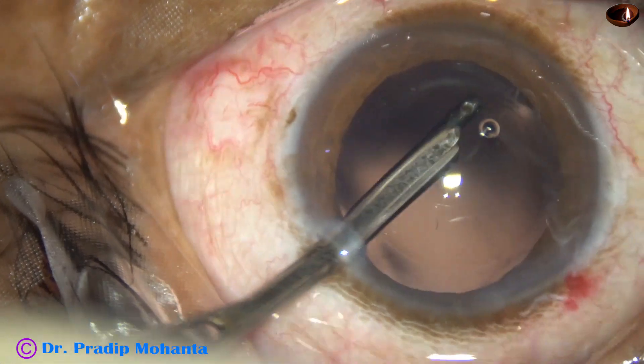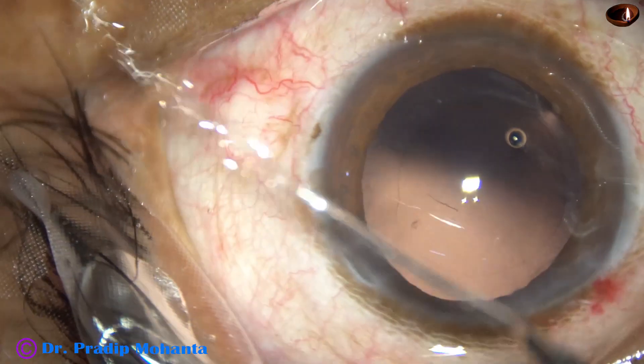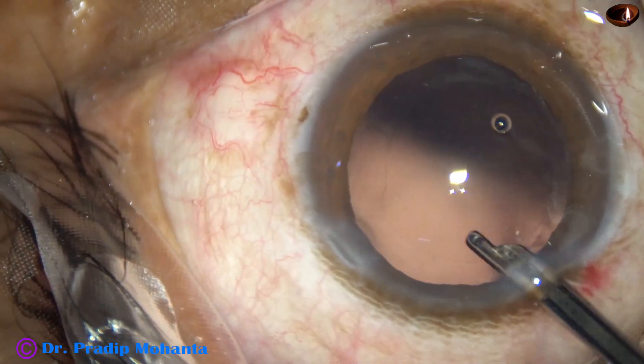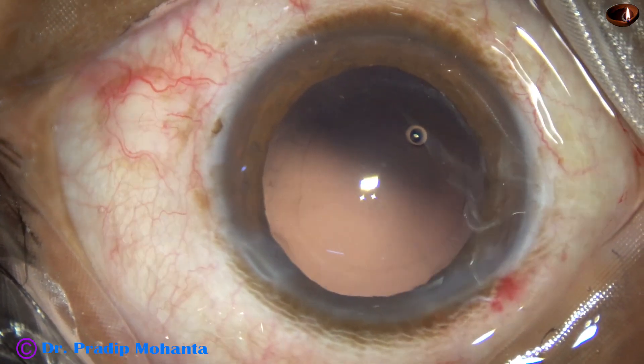Cortical clean-up has been done nicely. Whatever instrument we use, we must do a meticulous cleaning of the cortex. The posterior capsule is now clean.